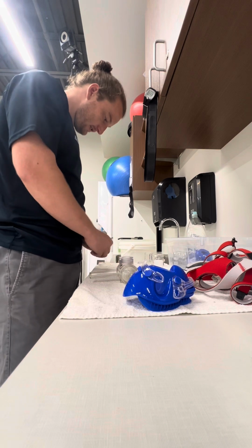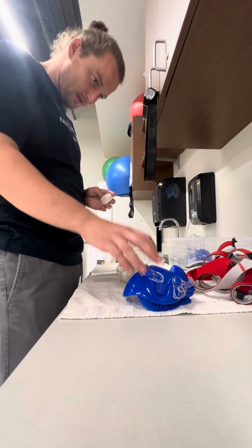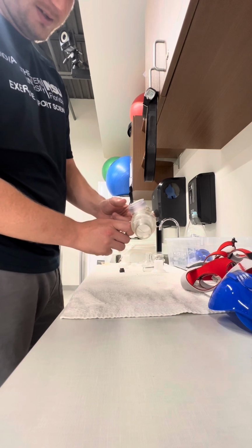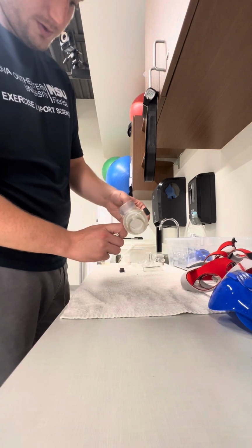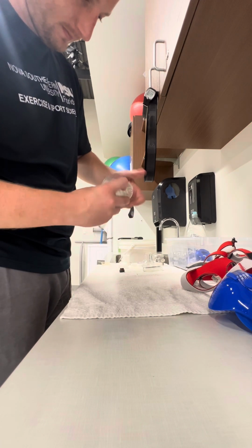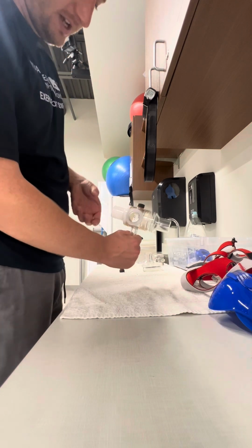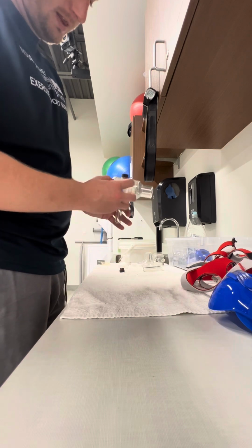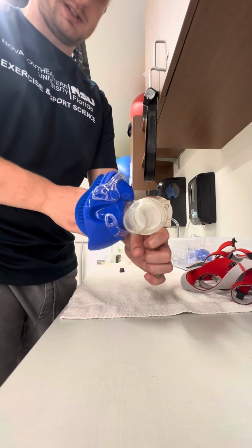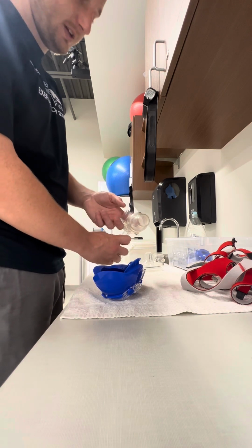Construct our other diaphragm. This one goes in to take the air in, and this opaque piece goes on this side. Cool. So now we have our one-way valve taking air in from out here. The mouthpiece connects the blue mask onto the entire mask, and then the tube will connect to the air out so that the metabolic cart can collect the expired gases.